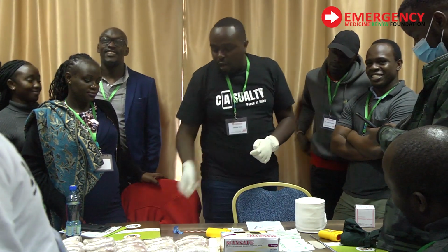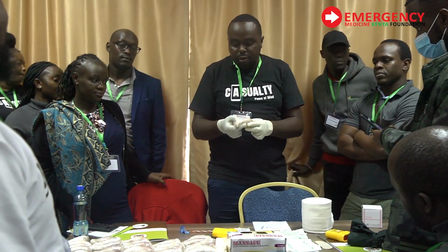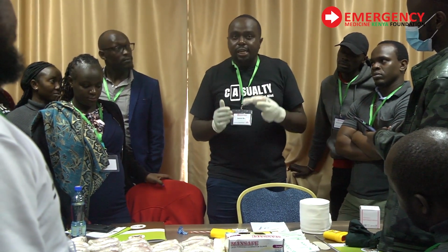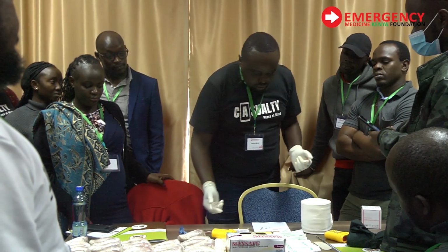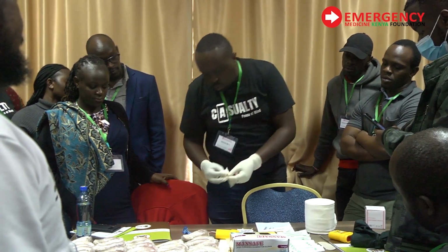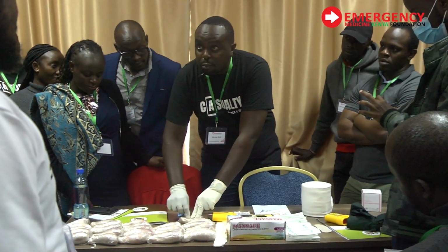Okay, great. So I'm going to attempt doing the intraosseous access on the distal part of the femur of this chicken thigh. Then you have many thighs. Each one of you will pick one, attempt it, and we'll be recording to see how successful you are. First steps first: once you locate your site, you would use spirit, you would swab. Upon swabbing, you need to locate a flat surface of the bone.